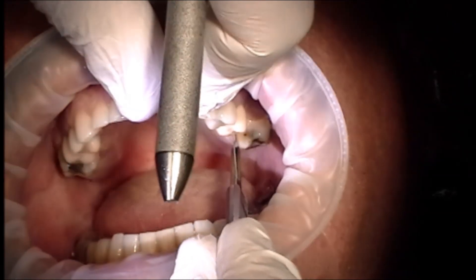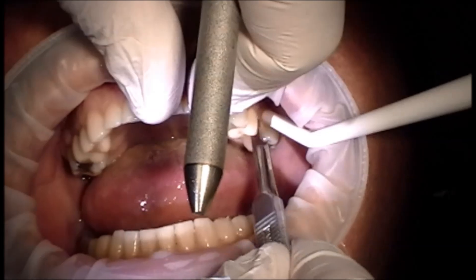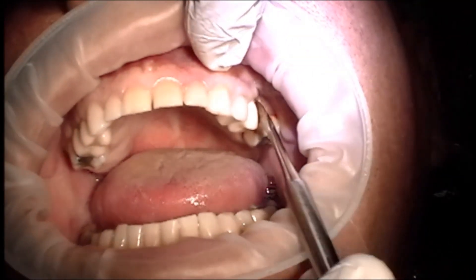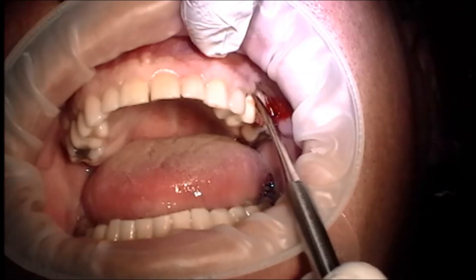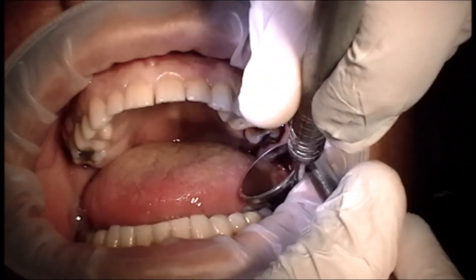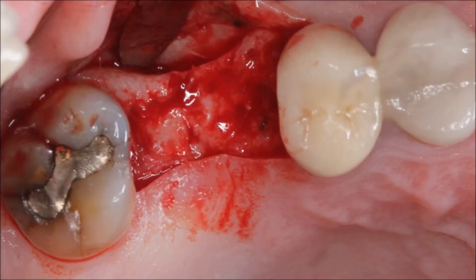Now it's time to do the surgery. I'm making my initial incision through the crest, full thickness, and I always make this a little lingually displaced because I want to be able to roll all that tissue to the back of the buccal and not have the incision line sitting directly over the implant site. You don't have to make a big flap — you really just need to reflect this just wide enough that the flap will clear the guide during the surgery. We don't need to visualize the entire buccal portion of the bone because we've already done our planning in the software. That's plenty enough reflection — you can see there are no releasing incisions of any kind, and you can see the crest of the bone.